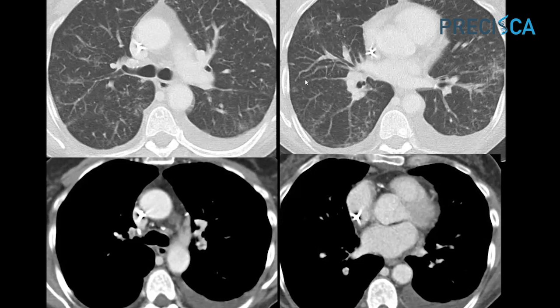We saw no filling defects on the soft tissue windows, but instead, what we saw was that there were vessels that are normally not seen on the CT. Normally, these vessels are too small to be seen this far peripherally, but these vessels are engorged with tumor, and as a result, you can follow them almost all the way to the pleural surface.